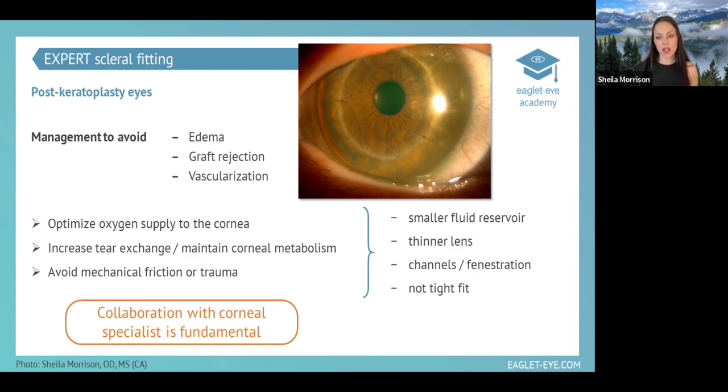On eyes that are compromised, a lot of the shapes of these eyes, of course, are more oblate, where we may have a central area at an elevation, a mid-peripheral button that has a height that's high and it may drop off suddenly. We want to avoid that mid-peripheral touch, absolutely, because touch in these areas can also increase the likelihood of edema, rejection, and blood vessel growth.